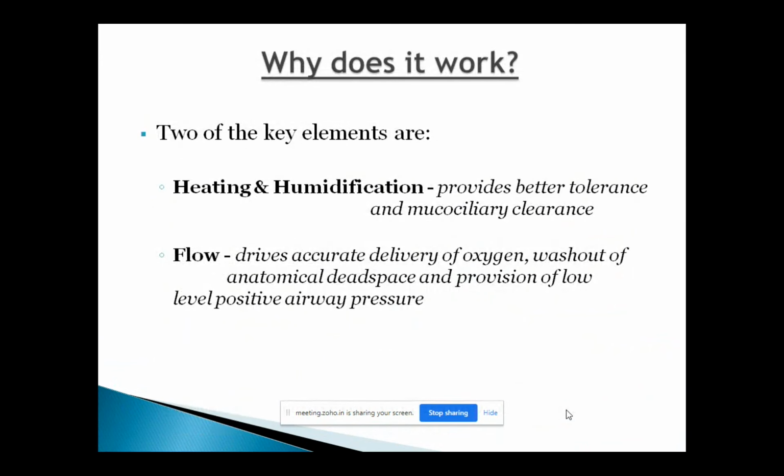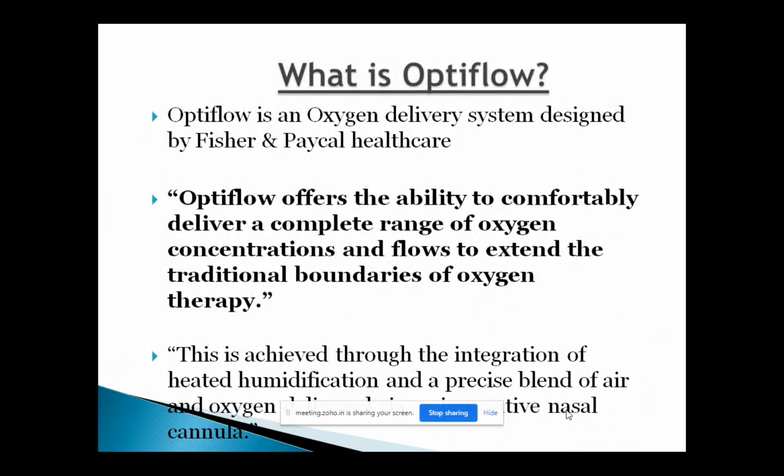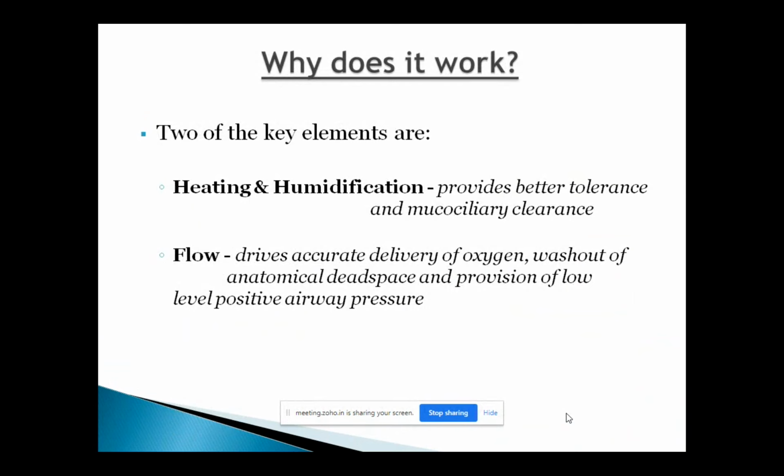But in this device, we are going to give a minimum of 30 liters of flow through the nasal cannula without causing any damage to patients.